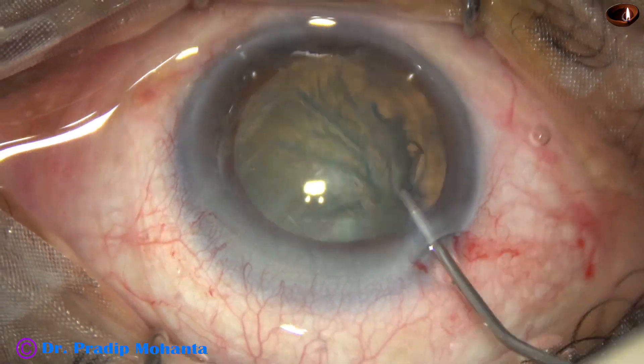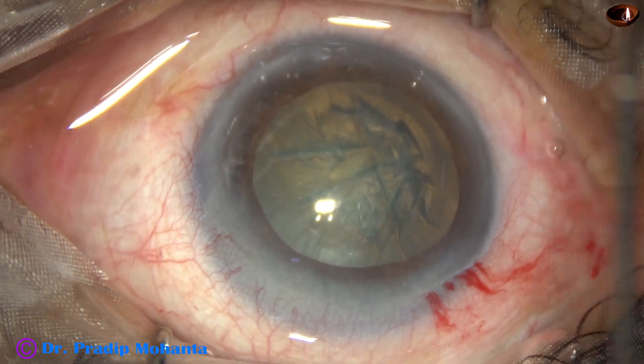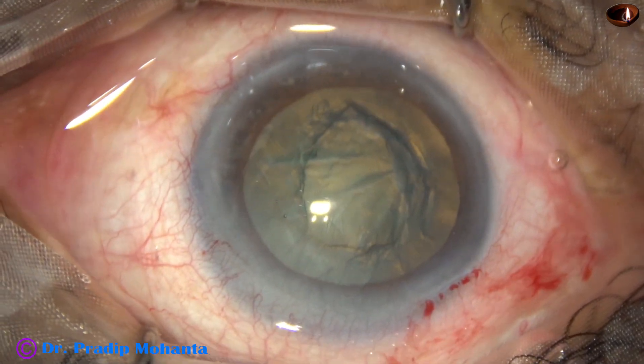Hydrodissection is done and the nucleus is rotated. HPMC is again used to fill up the anterior chamber.